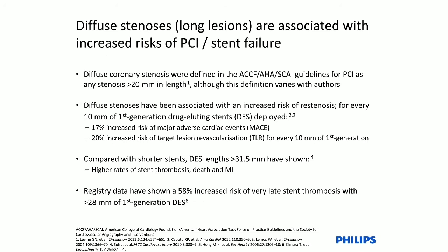Now, the very definition of diffuse stenosis or long stenosis is a matter of discussion. Conventionally, some documents have used the definition of more than 20 millimeters in length.